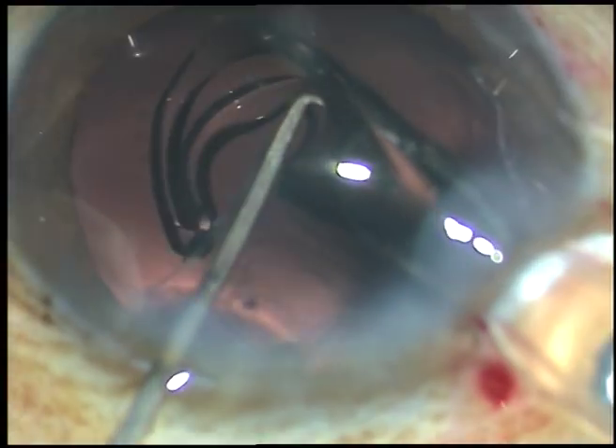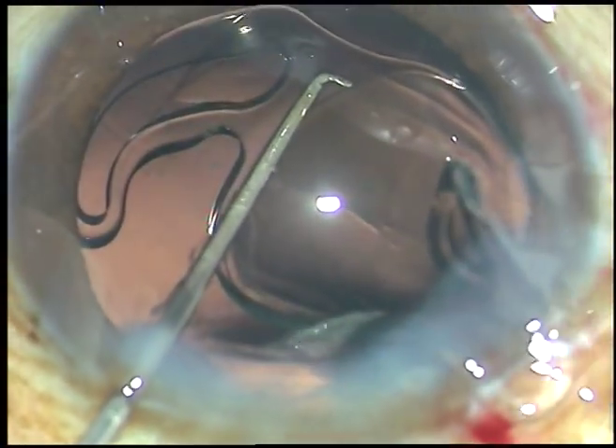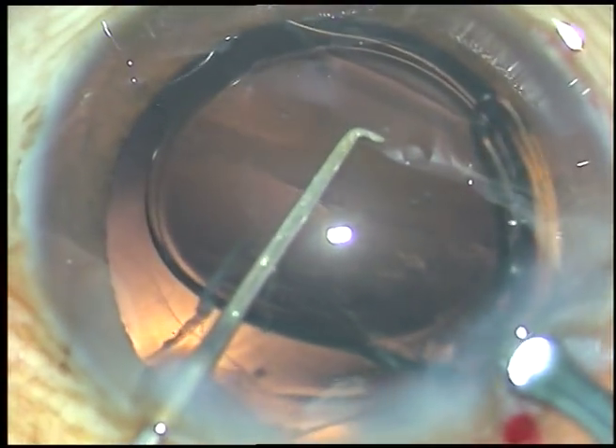Here goes the intraocular lens. The leading haptic goes into the capsular bag. The bag has been distended with viscoelastic substance. And now the trailing haptic is gently pushed into the anterior chamber.